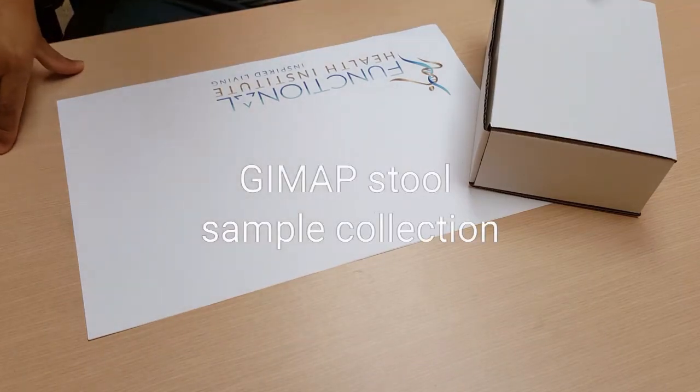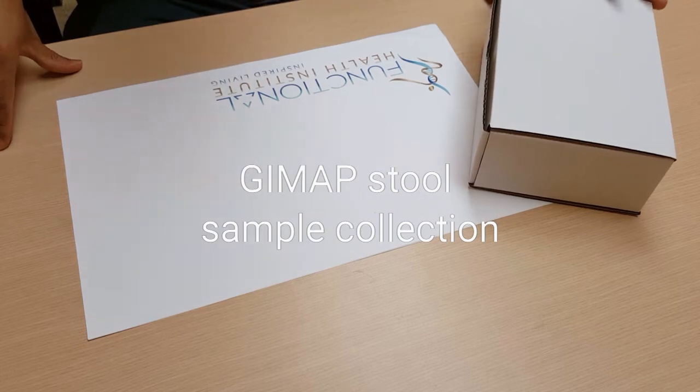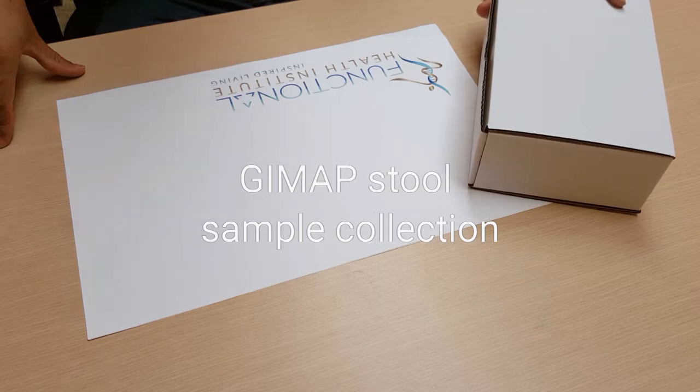Hi everyone, this is Dr. Binning. I'm going to go over how to make a stool sample collection in case you have a test kit from Diagnostic Solutions.